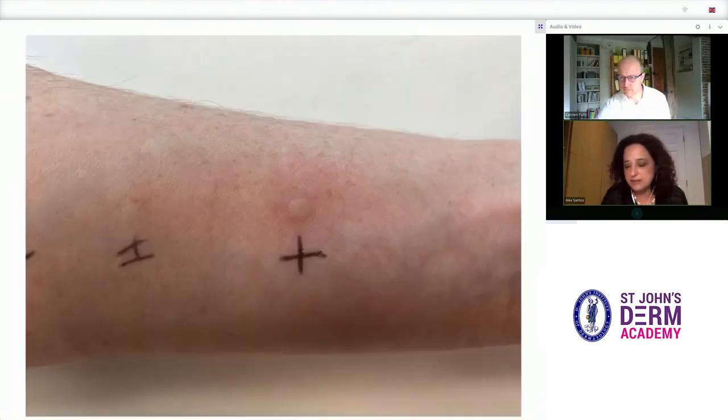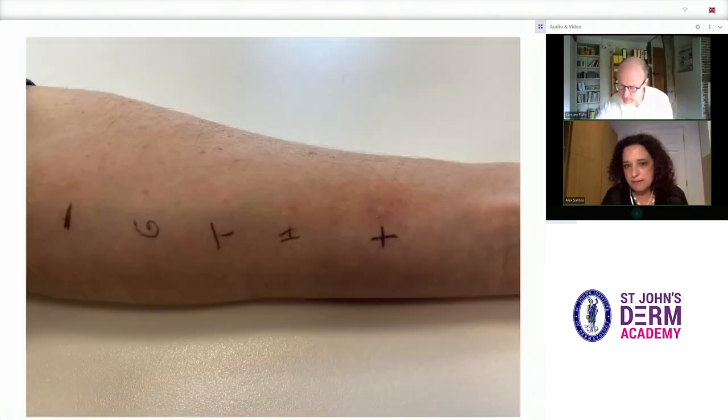Finally, this is a comparison showing a patient who had a strong positive control reaction but negative results to all allergens tested, and of course to the negative control.